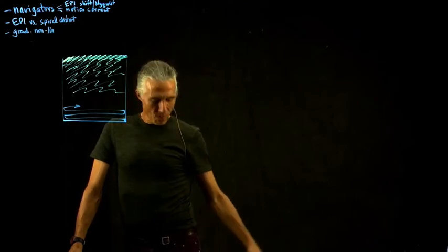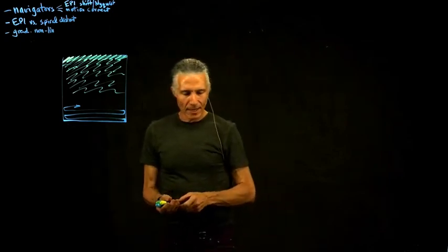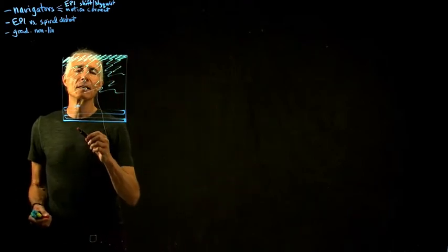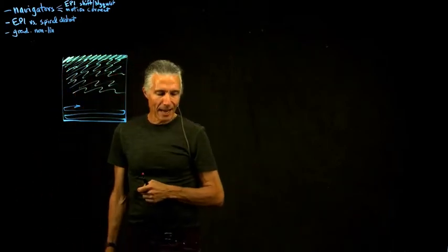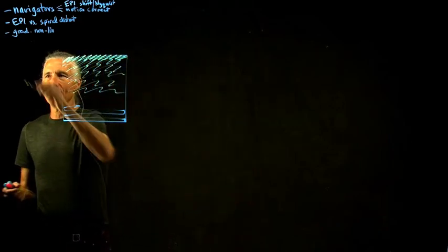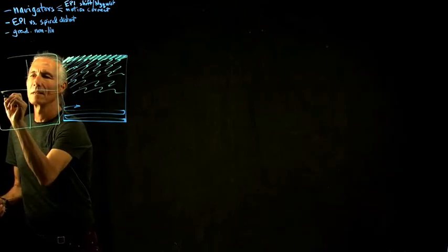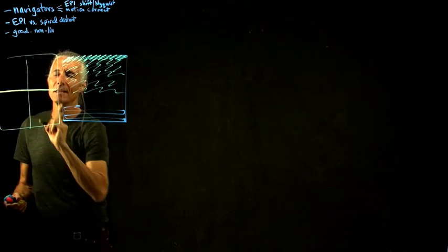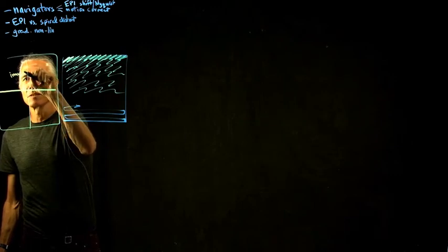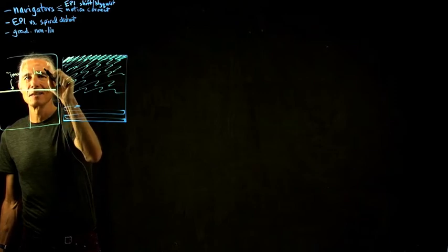So what does that actually do to the image? It's a little complicated. So let's just take a case of an image that's say just a line. So this is k-space. So here we'll draw the actual image over here. Say the image was just a line like that, because a line is kind of easy to deal with. Here's our image, just a line.